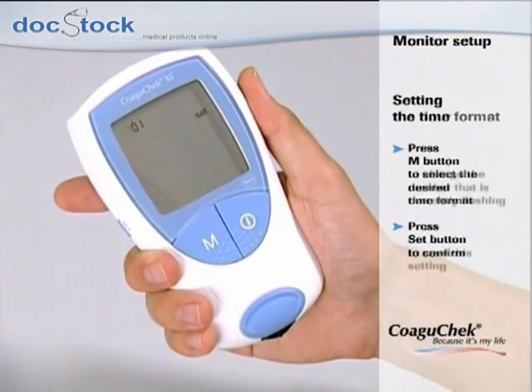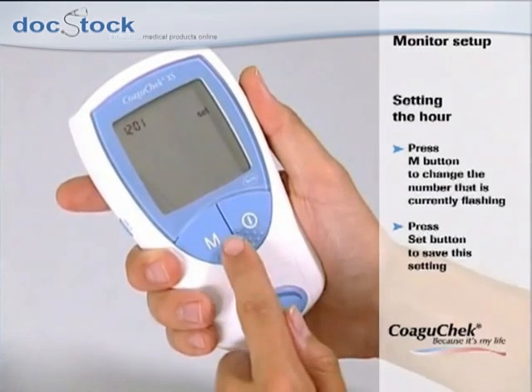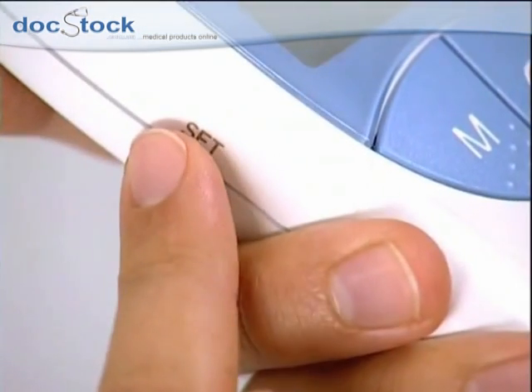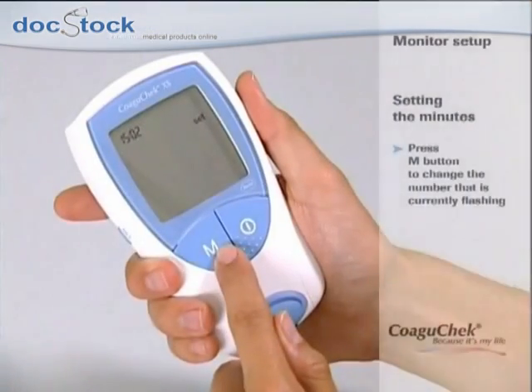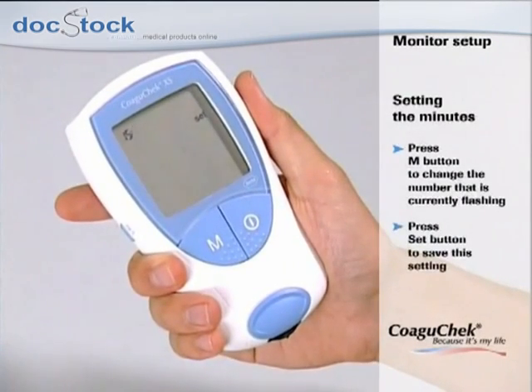The display changes to the time setting. First, press the M button to change the hours and save your setting. Then repeat the last steps to adjust the correct minutes. Finally, press the set button to save the new time settings.